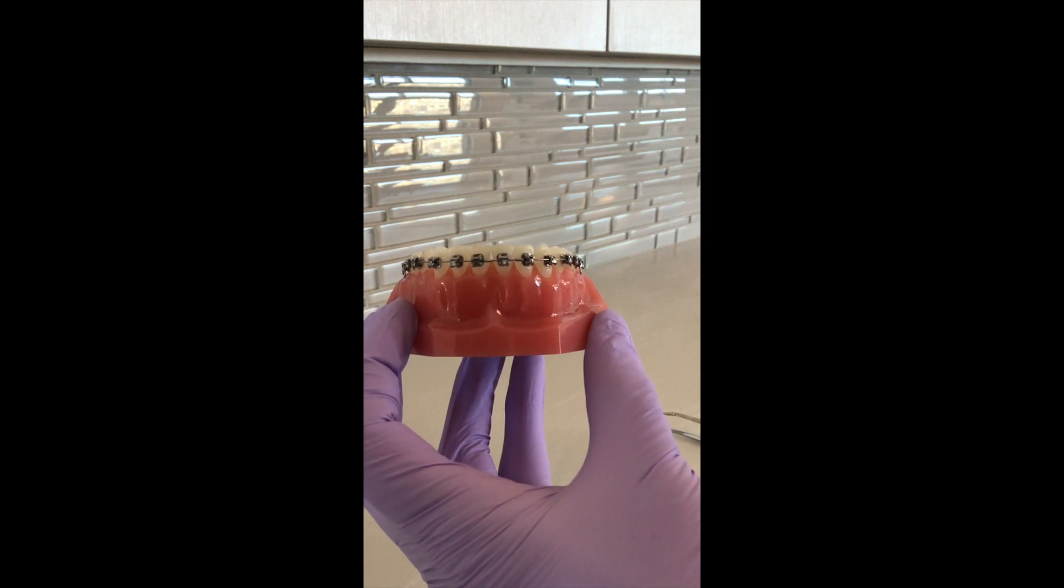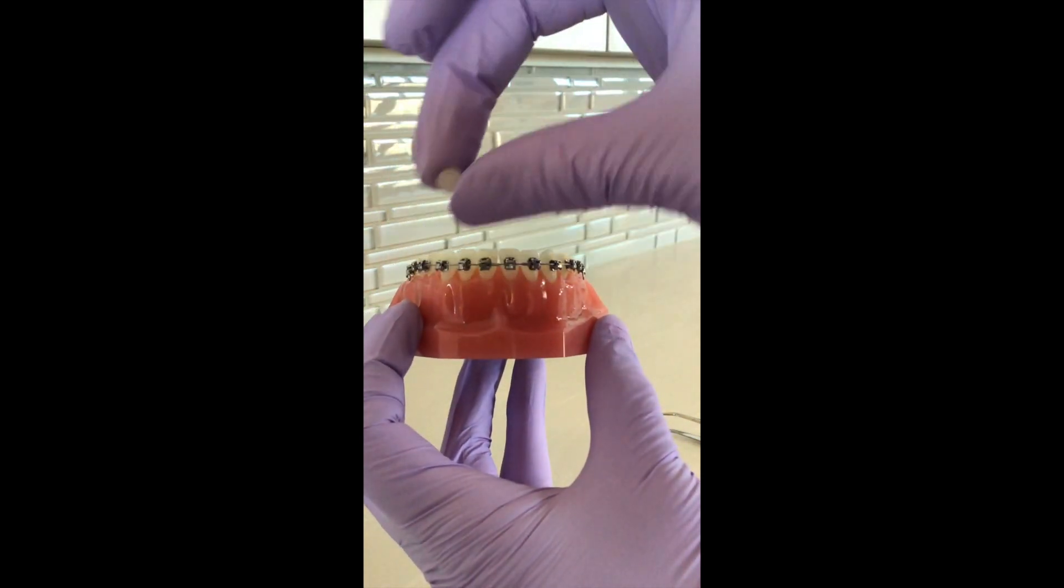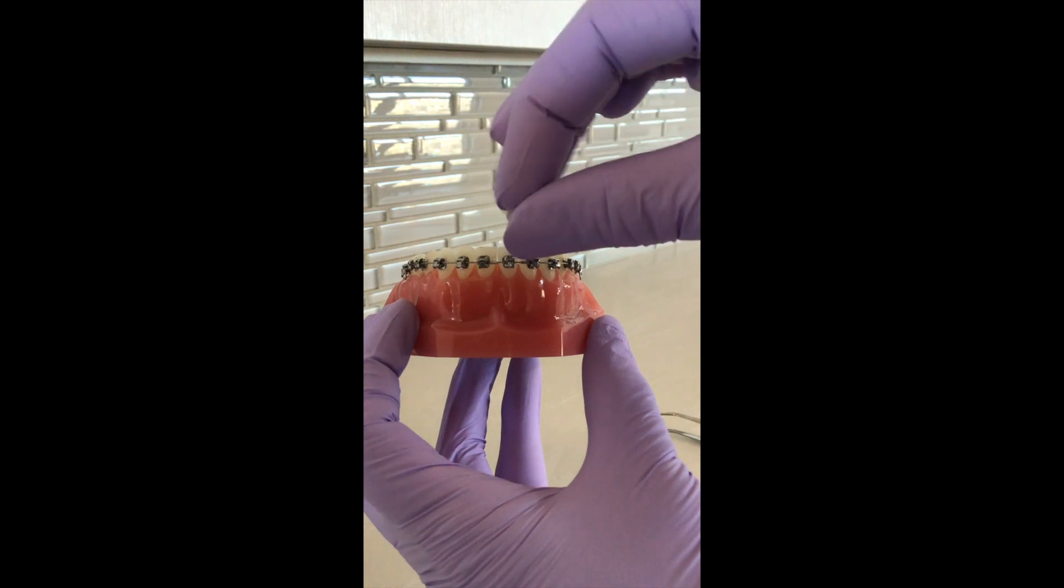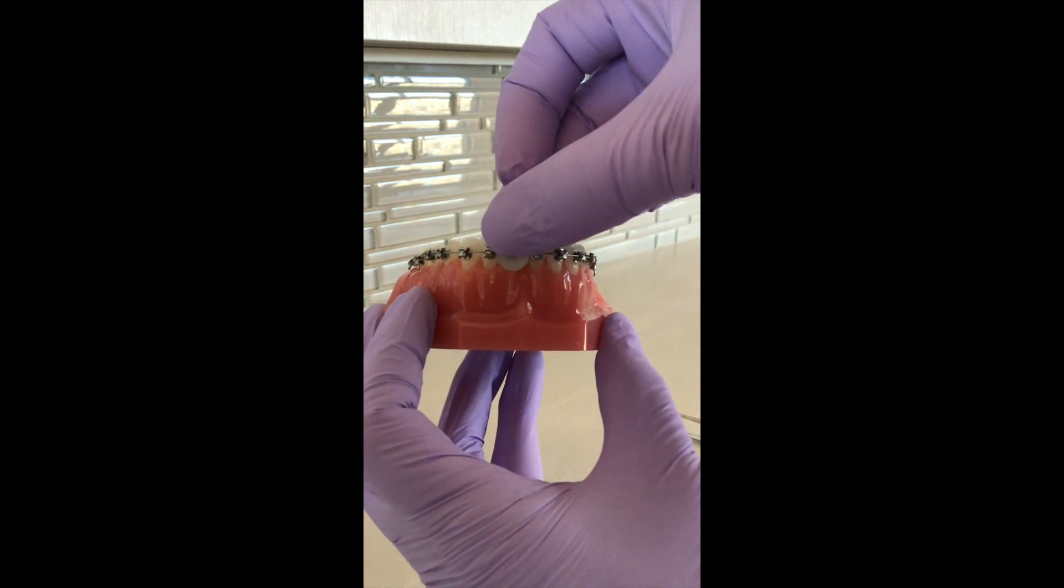If you have a bracket that's sliding around anywhere on the wire, it can be any of these ones except for the very back. You can grab a little piece of orthodontic wax, rub it around in your fingers like this, and push it on to stabilize that broken bracket.